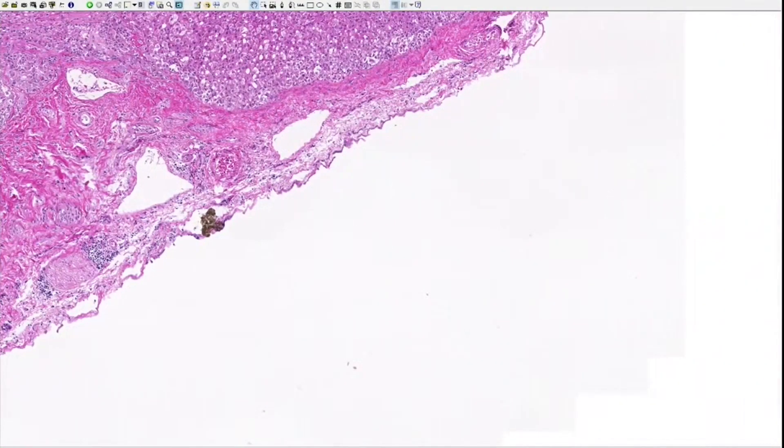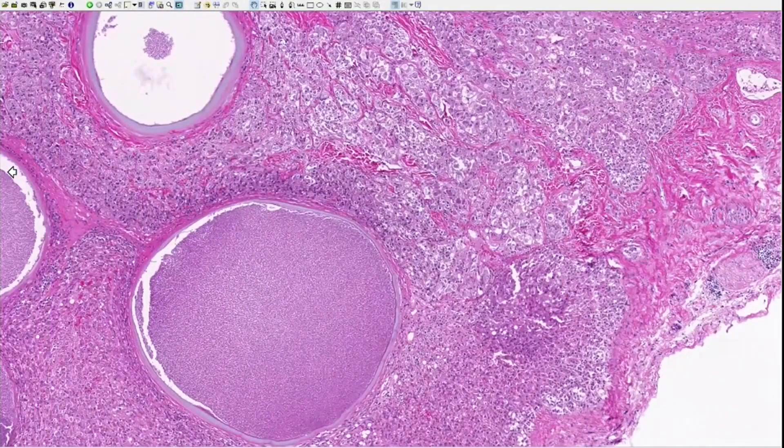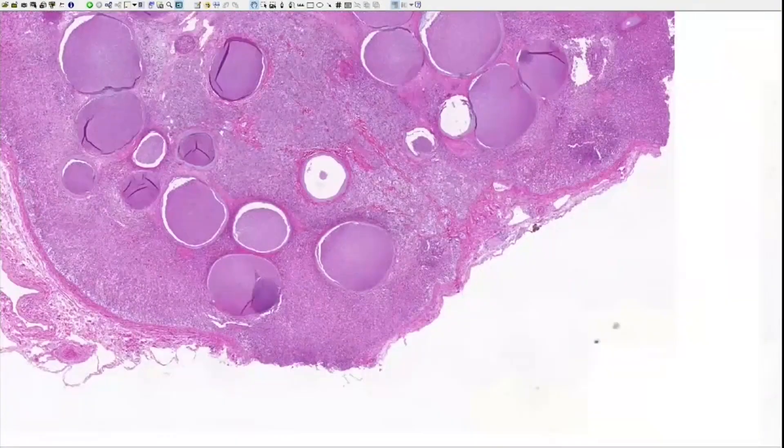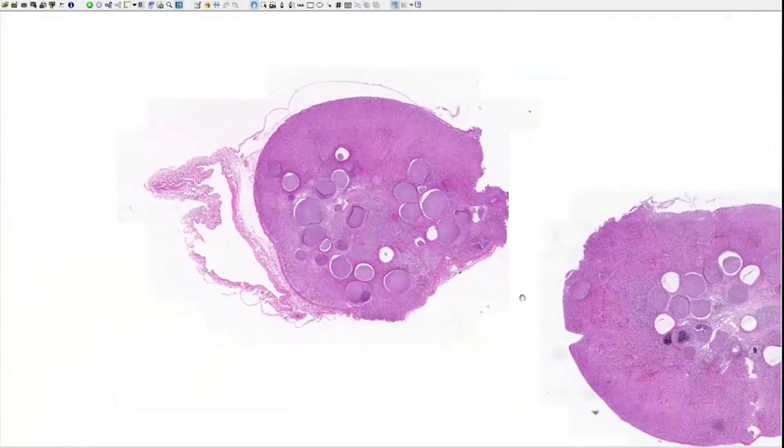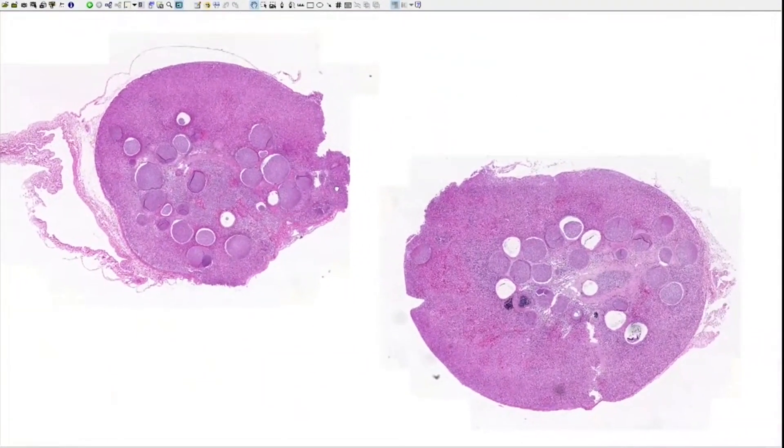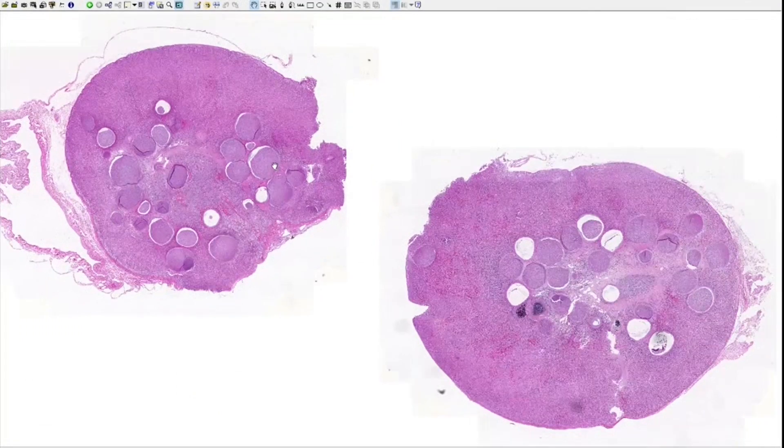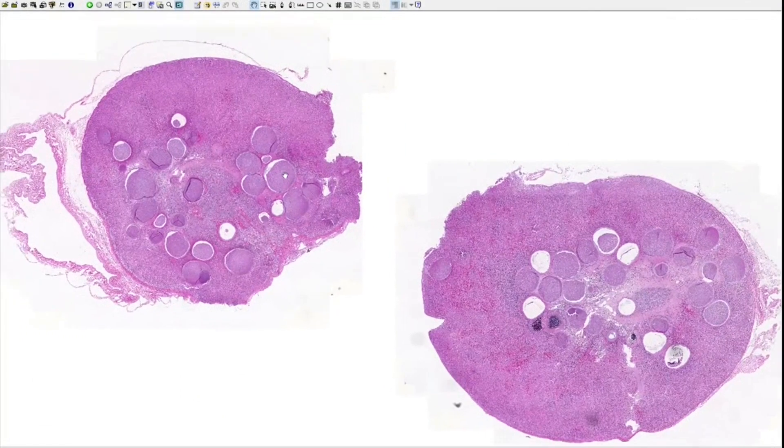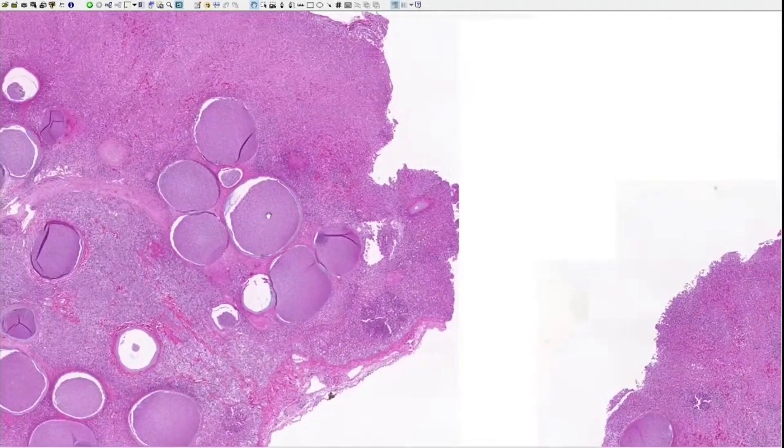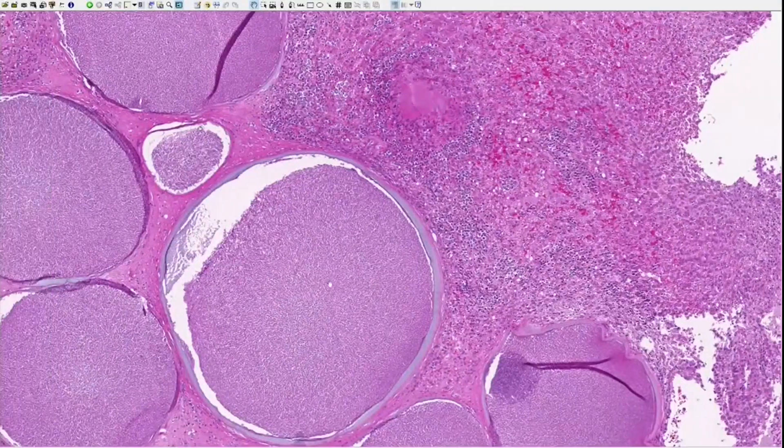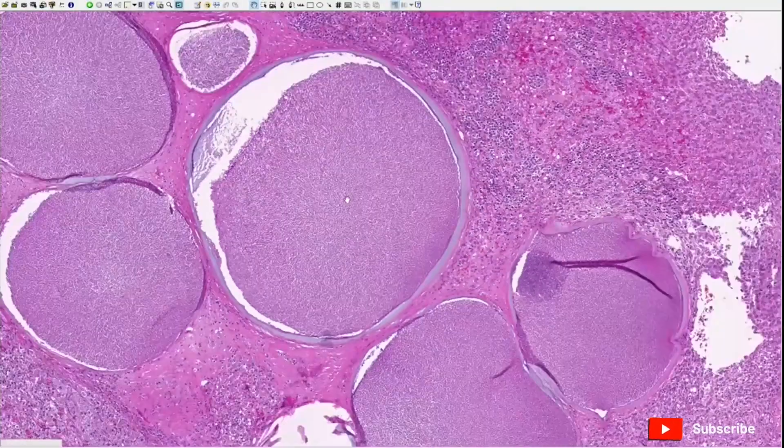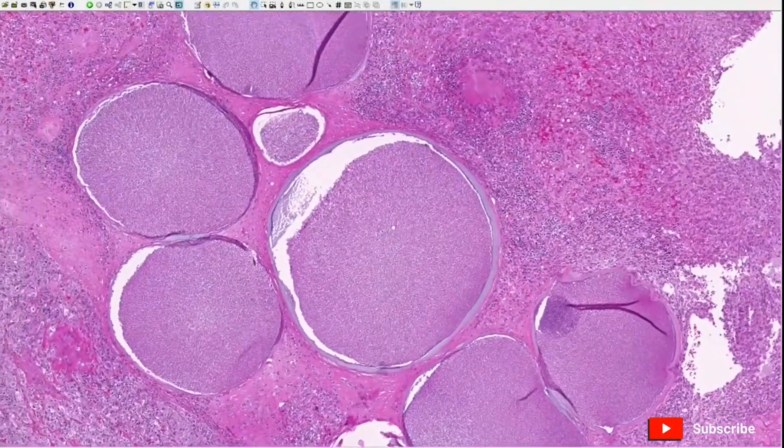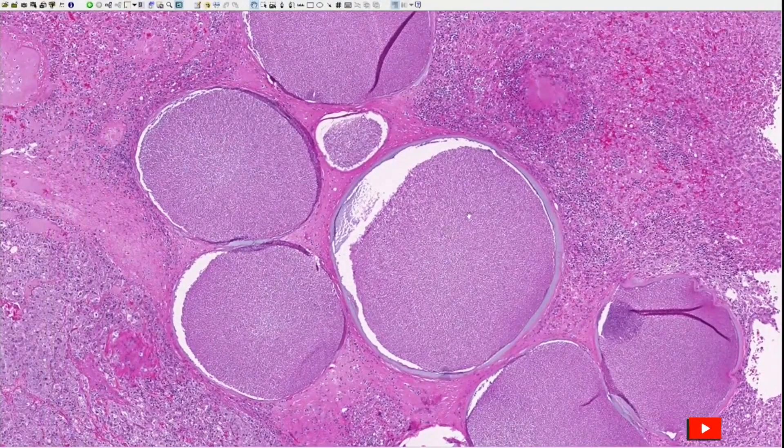This is an adrenal gland of an opossum, and the circles here are parasitophorous vacuoles of Besnoitia species, an apicomplexan parasite. We're going to annotate a few of them.